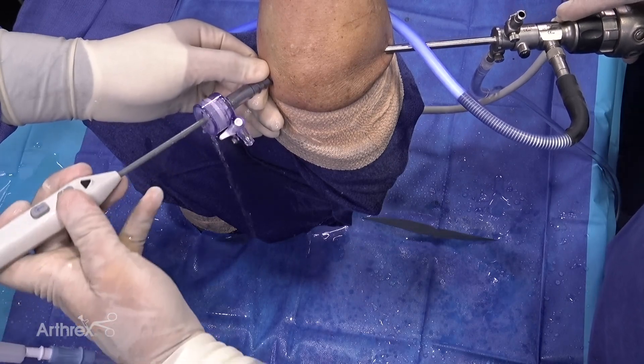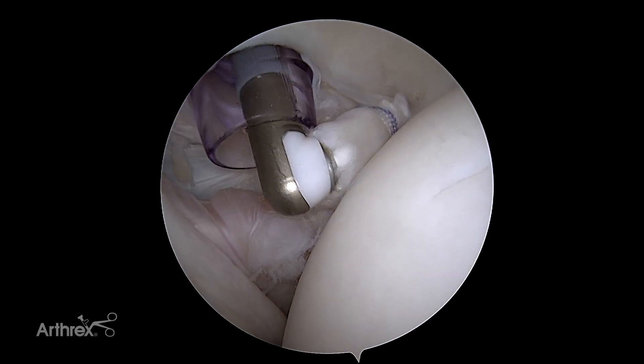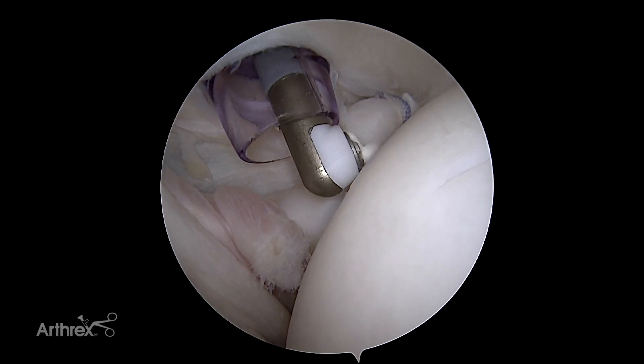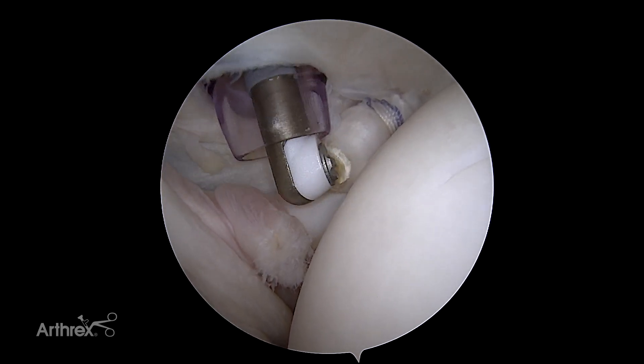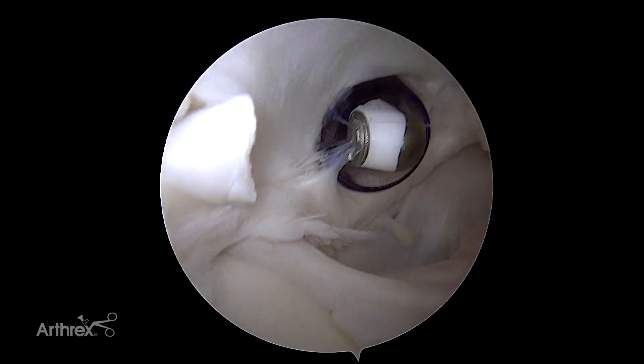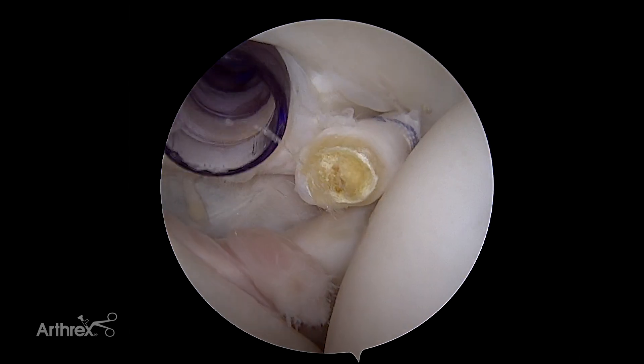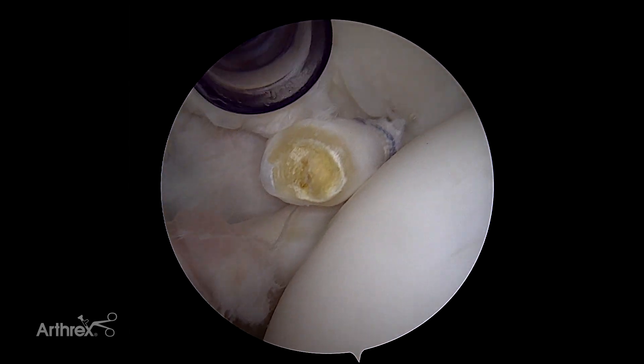At this point I like to insert my Apollo RF probe to actually mushroom the tip of the biceps and take the very top of the biceps back so that very little stump is left. You can then look at the top of the superior labrum and resect the excess biceps from that end as well. And this will be your LupinTac tenodesis.